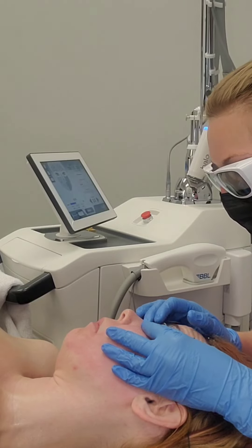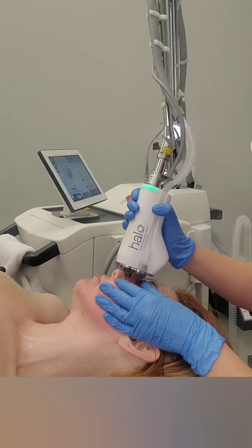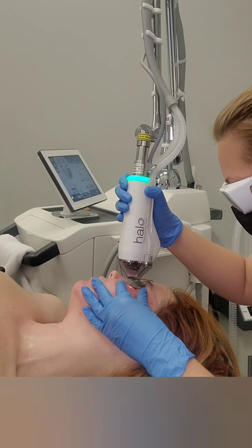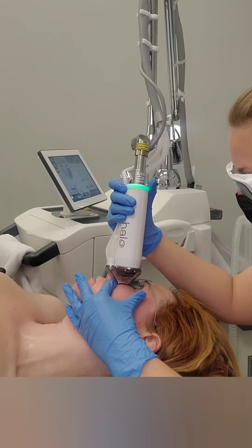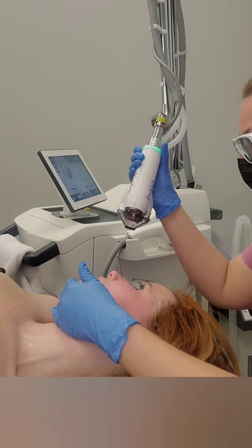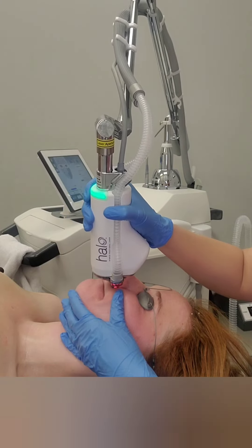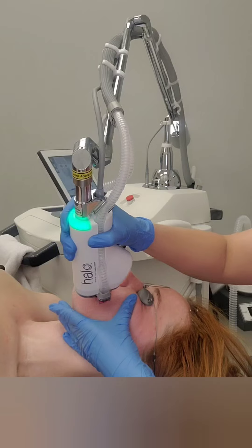If you happen to be a provider watching this and you're considering purchasing the Halo — don't even think about it a second longer, call your rep today. This thing is so worth it. I researched lasers for over two years before working on a pro forma for my administrator, because I work for a large company associated with a hospital and university. You have to prove that the money you're asking for is going to bring in a profit. And hands down, Cytan is the best laser device out there.